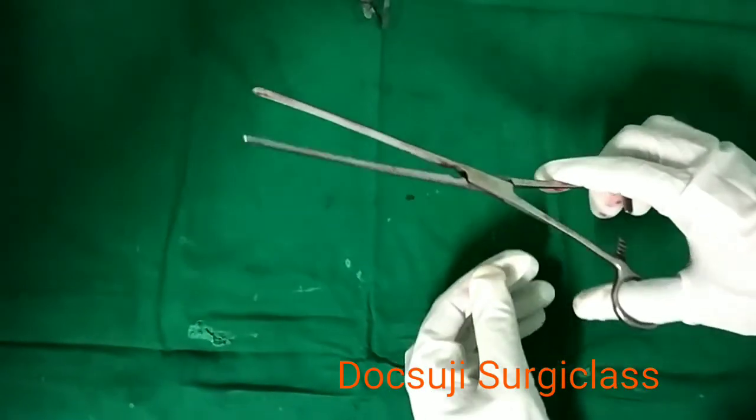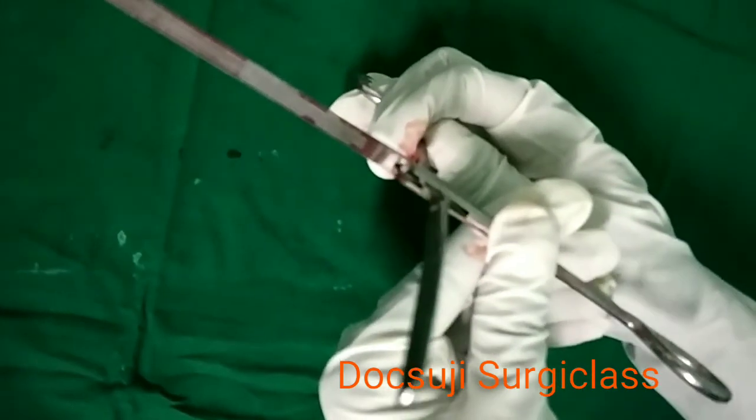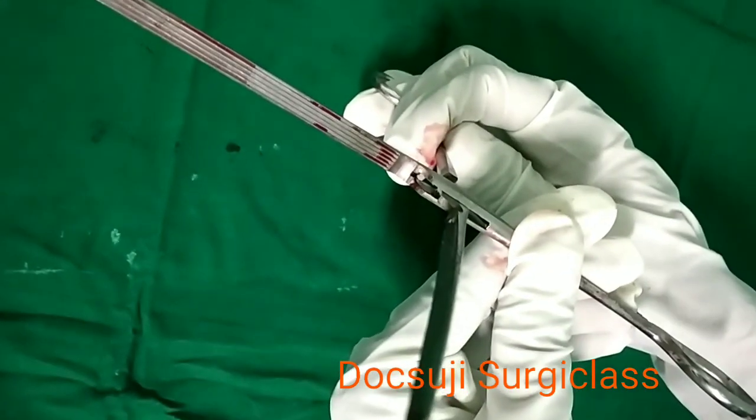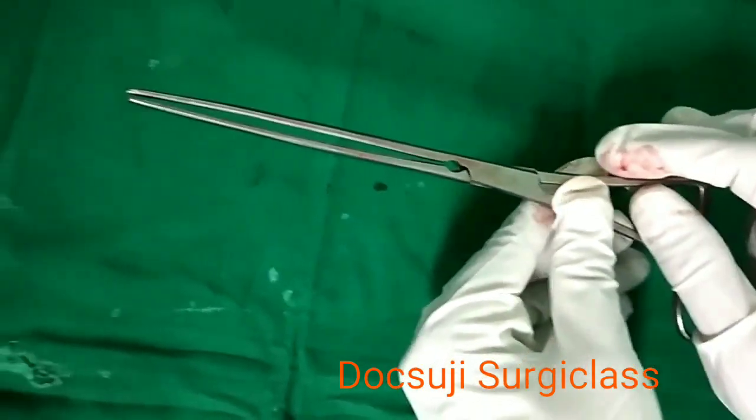This is Doyen's intestinal occlusion clamp. The instrument is shown open, demonstrating the vertical serrations of the blades. Thank you.